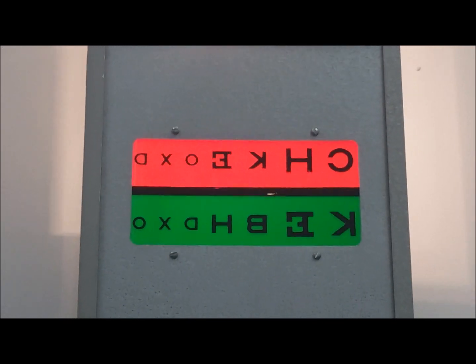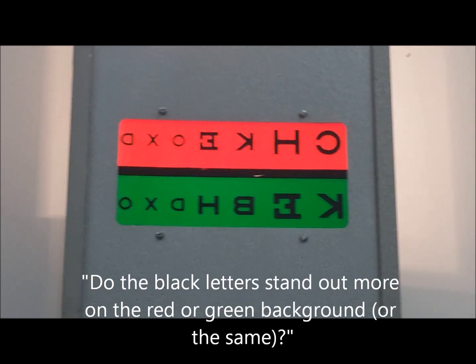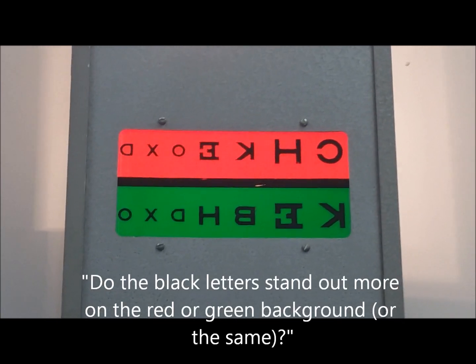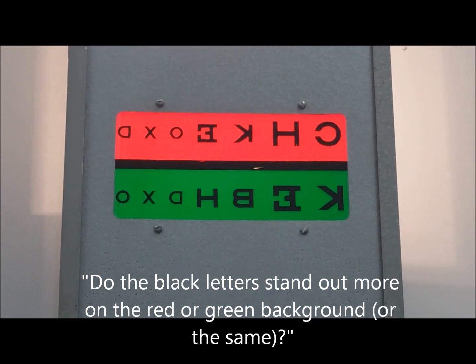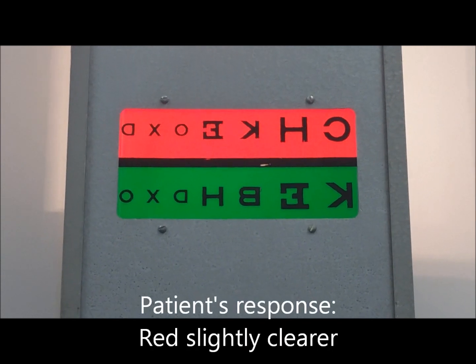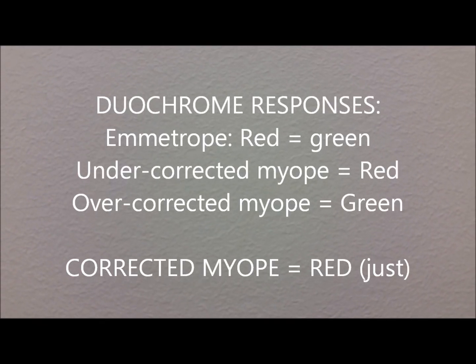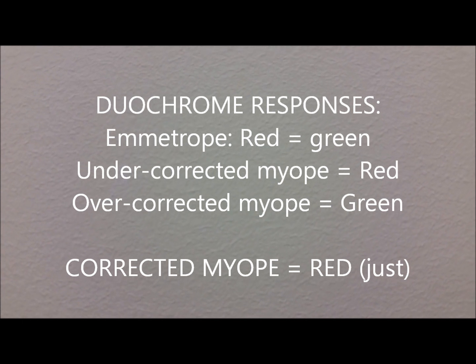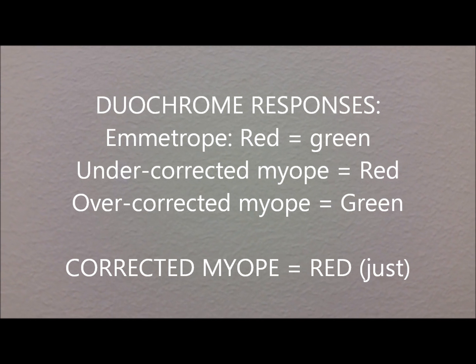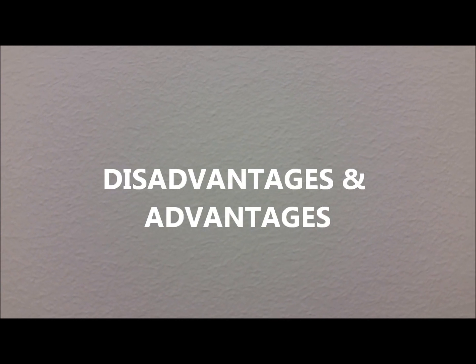The patient is asked, alright, Hongbin, I just want you to tell me if either of the letters stand out more on the red or the green background, or are they about the same? They are almost the same, but the red is a little more. As Hongbin is a myope, his response indicates that he has been adequately corrected. Overall, the reliability of subjective refraction is high.